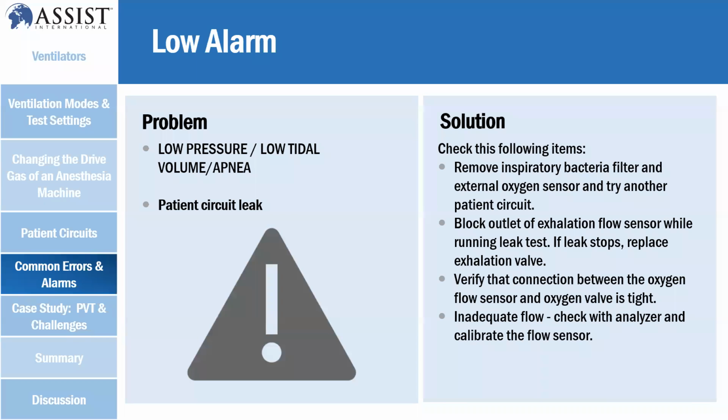What happens is your patient data and your setting look very different, and the outcome on the ventilator analyzer looks different. For example, your setting is 500, but your patient data shows 700, and your ventilator analyzer shows 600. 500 means the tidal volume plus or minus 10 percent, so it should be somewhere between 450 and 550.